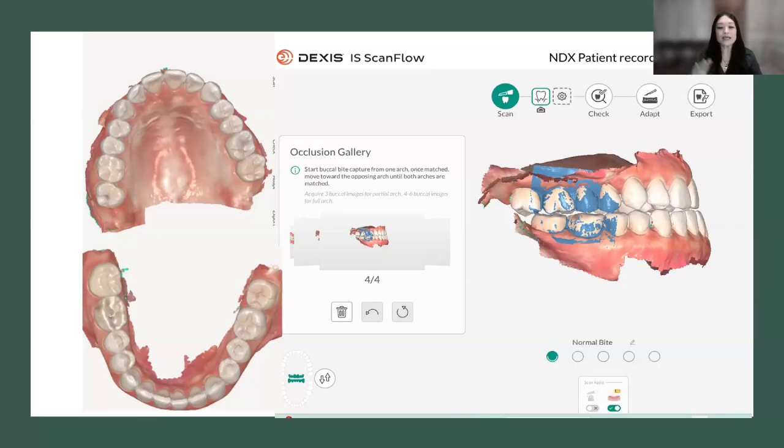So when I take the bite scan, I put the scan in the mouth. I will show gingival tissue of the upper teeth. You'll watch the blue bite registration line up right into the model. And I will move my hand down, showing it the lower gingival tissue, and you'll watch the blue bite touch the lower model or mandibular. The action of the hand moving out of the mouth resets the bite to allow you to take more bites. So we want to do that 2 on each side. And that'll give you a solid bite, very predictable. You know that it's going to be perfect because you have 4 anchor points.